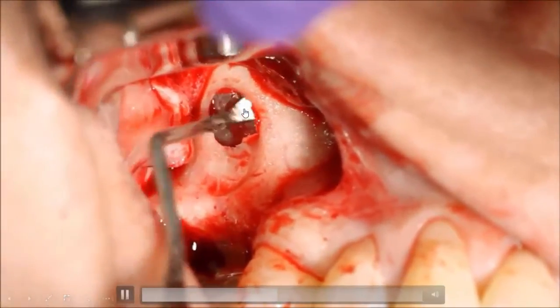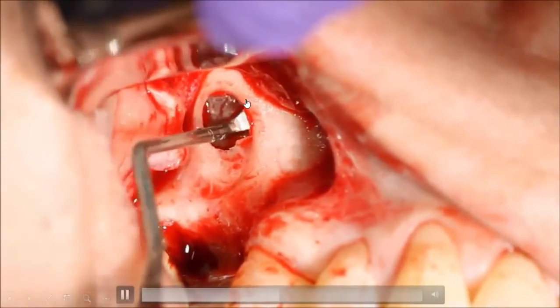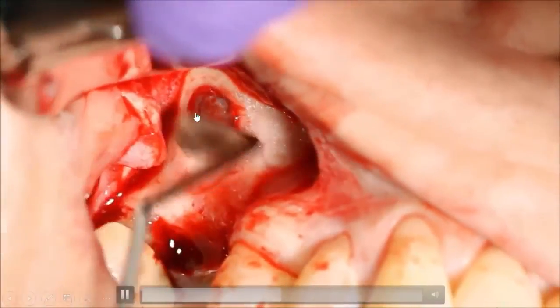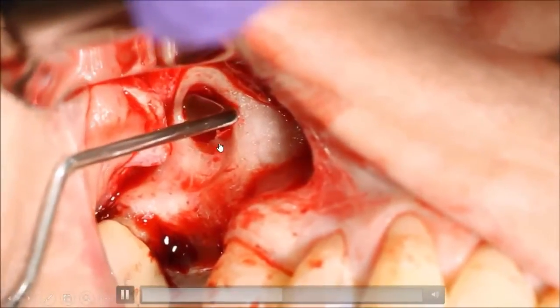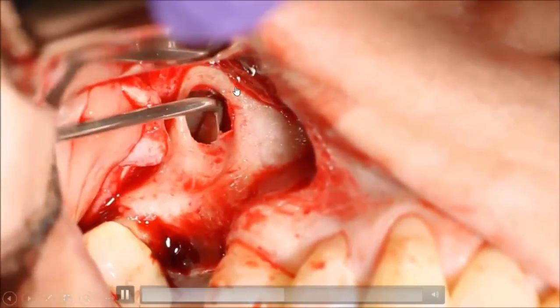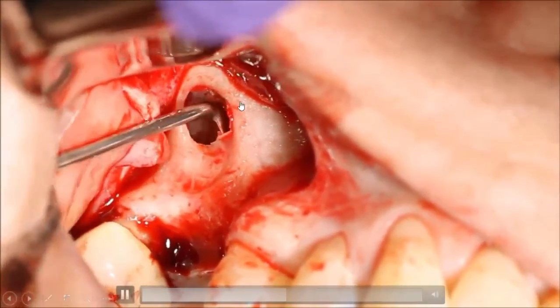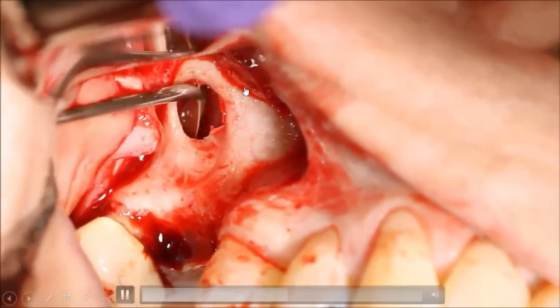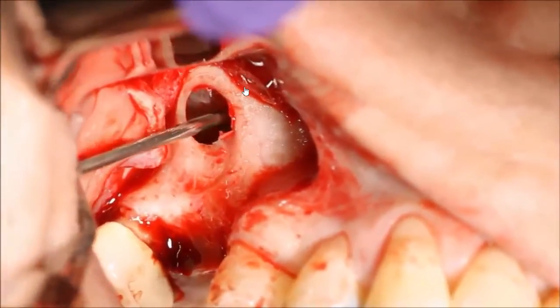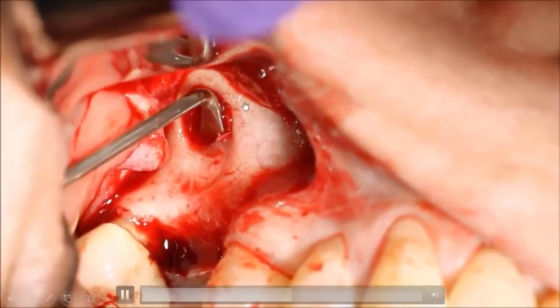هلا في حال إذا صار معنا أي perforation نحن ساعتها بدنا نعمل extension للويندو beyond the perforation site. يعني لو كان عندي perforation هون أو هون أو هلا تحت حيكون very صعب مثل ما حكينا، بس إذا كان عندي perforation فوق بعمل extension أنا للويندو beyond the perforation وبكمل ال elevation beyond the perforation. فلما بعمل أنا elevation beyond the perforation the sinus membrane itself is gonna fold on itself, so it's gonna close the perforation. طبعا بنستخدم هون collagen membrane also to cover the perforation.